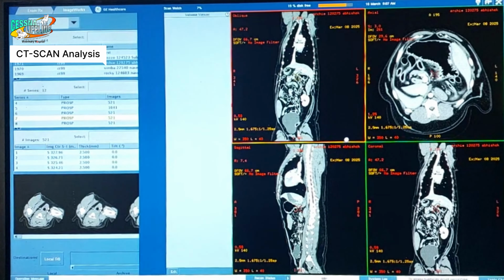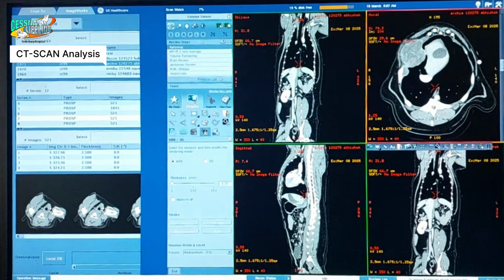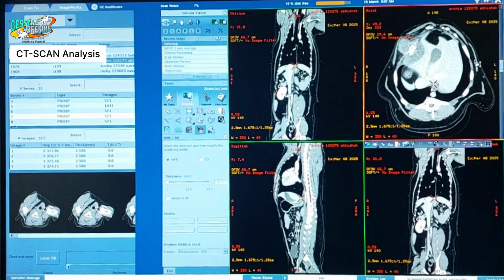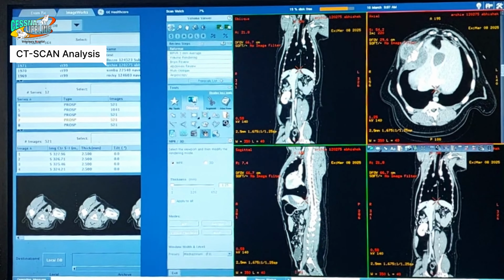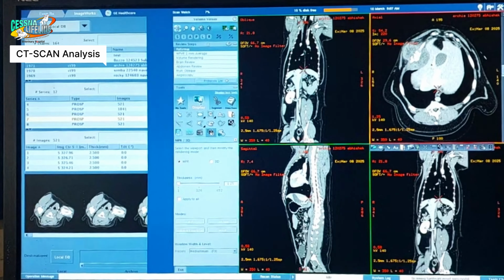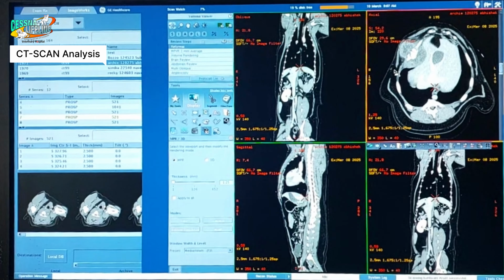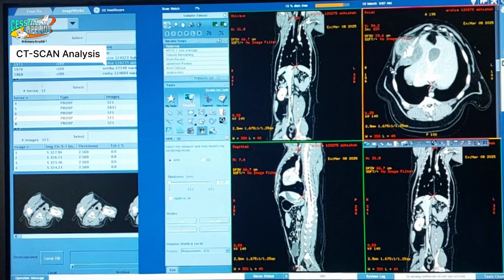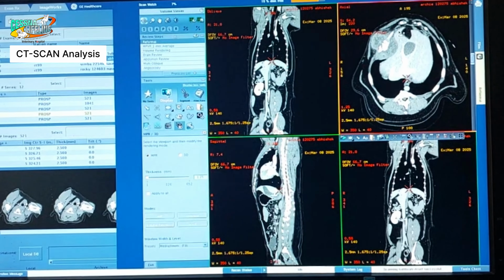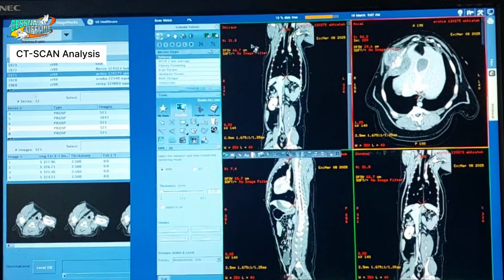So in this surgery, you'll see the growth is just in front of the diaphragm. The diaphragm is starting from here. This is the area where the diaphragm is. So probably this must be attached to the diaphragm. Some part of the diaphragm I am going to remove, and probably I'll suture the diaphragm to the cranial ribs so that I don't get a flail chest condition. That will be easier for me because this is on the outer, on the last ribs.